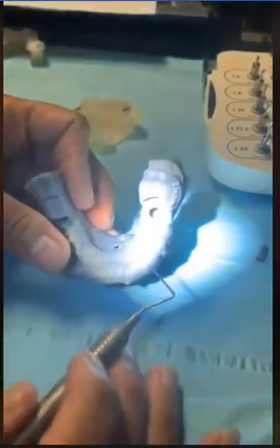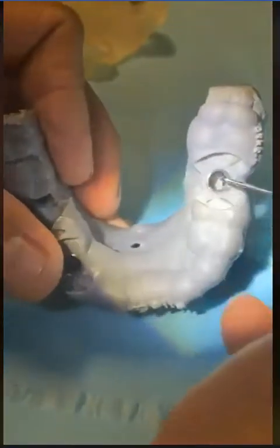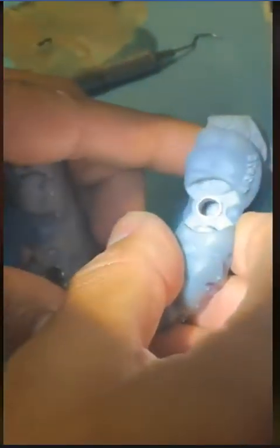You can see how much I'm missing here, right? I'm going to put my perio probe and look. So we'll definitely not put a 4.3 by 10 in this particular case. Either we'll do a graft or possibly a 3.5 or something like that. But for the purpose of education, we're going to go ahead and do that.